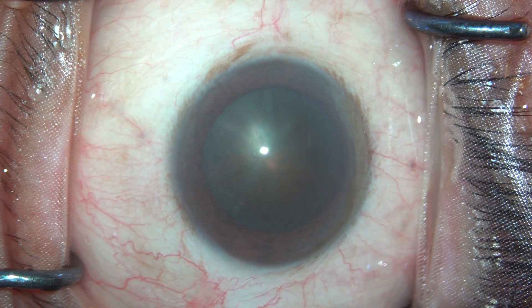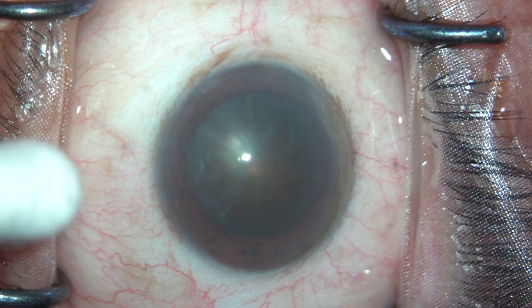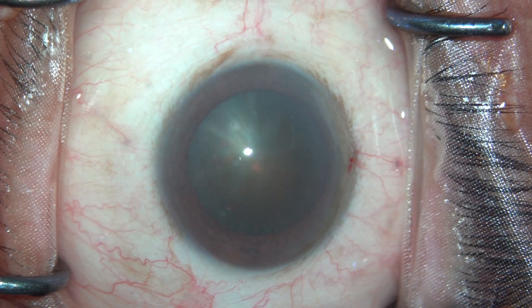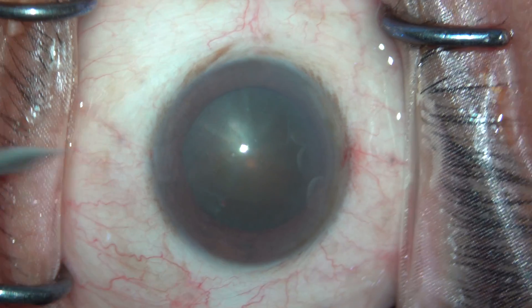Hello everybody, let's take a look at this case. This is about an NS 2 to 3 grade cataract planned for topical phacoemulsification using an MVR knife. I have started by making my two side port incisions.